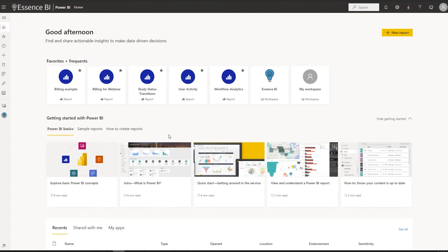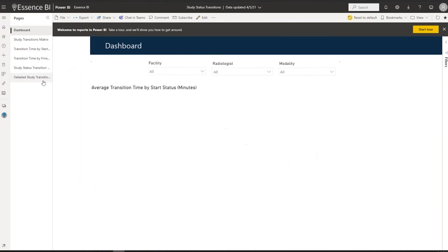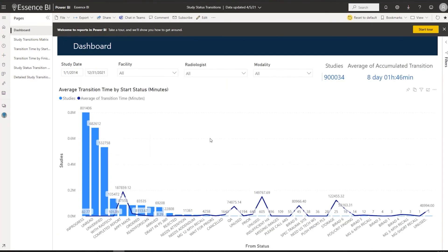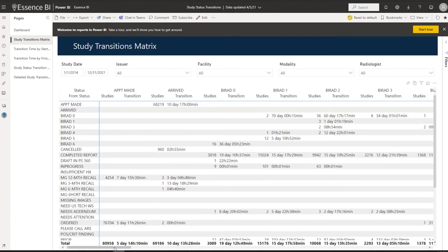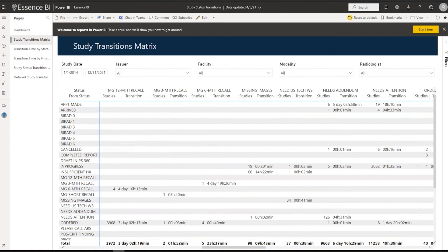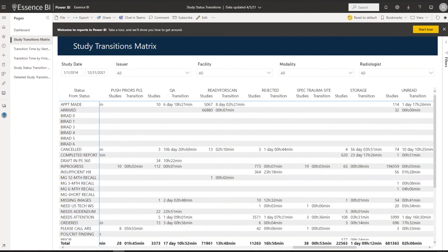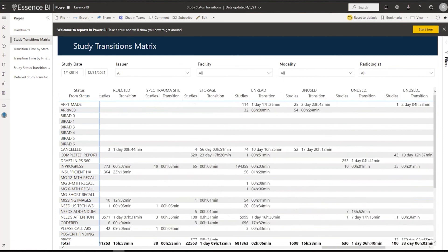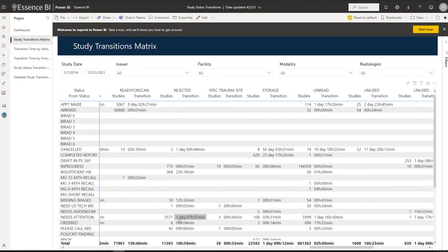Here's a year-over-year trend by modality, so you can see all your years right side by side — 2018, 2019, 2020. We can do all kinds of different graphs and charts in combination to display the data the way you want to see it. Next we're going to take a look at a performance report — great for decision makers. Here's a dashboard that shows transition times by radiologist, with three different filters and time filters. It's a study status transition matrix, showing all the study statuses from this facility and the transition times for each.